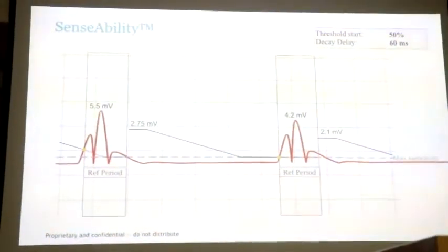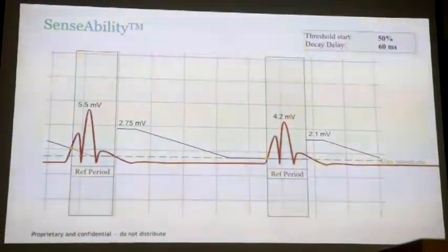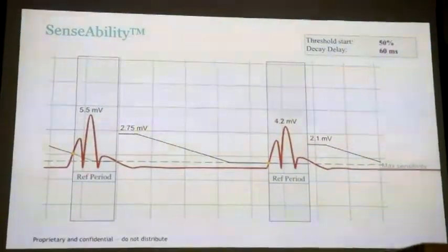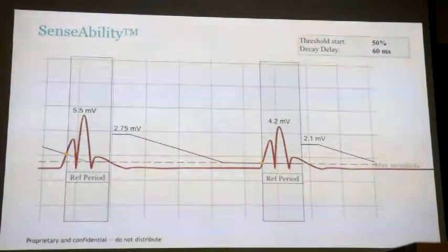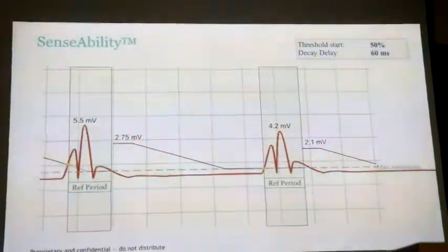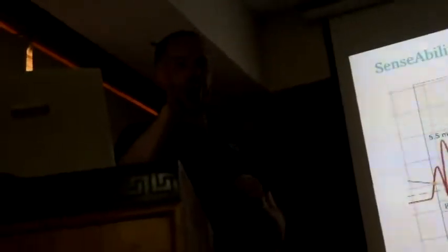There's one specific case I saw where the T wave was actually of a higher voltage than the R wave. Yeah, that can happen. Was that with an Abbott device? I don't remember the device. Yes, sometimes that can happen, and that's pretty unusual. I've got some cases, and you'll see what happens. But I would suspect that was with an older device. Probably was some time ago? Yeah. So it's an older device.